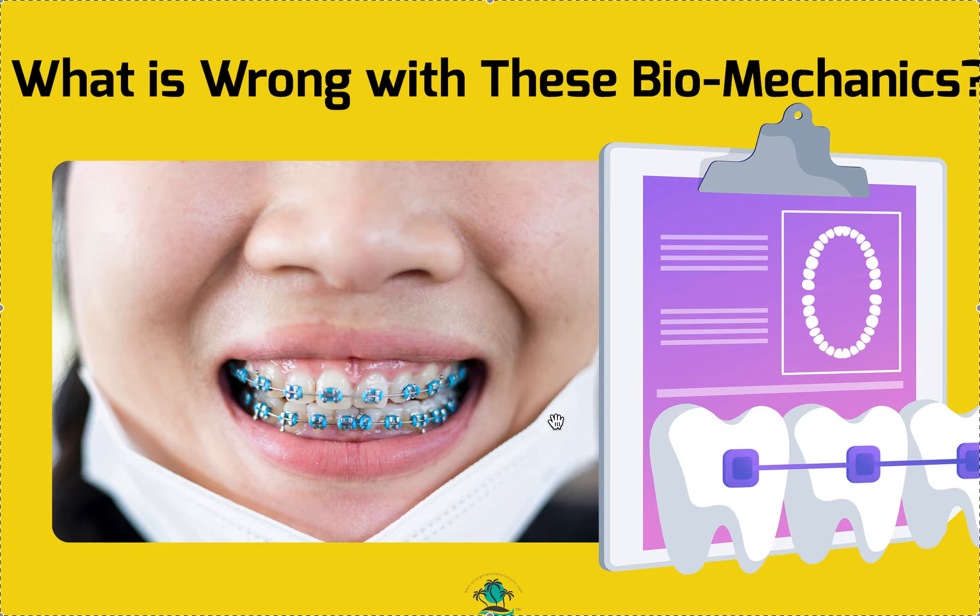Given the bite, I don't think the open coil spring is probably a great idea. I don't have the other pictures, but given that we're already at an edge-to-edge bite, something probably has to give. Either you're going to have to do a ton of lower IPR — maybe even the maximum of 0.5 millimeters — and these are already small teeth. I don't even know if that's going to work given that we need space here and we've got an underbite or edge-to-edge occlusion.